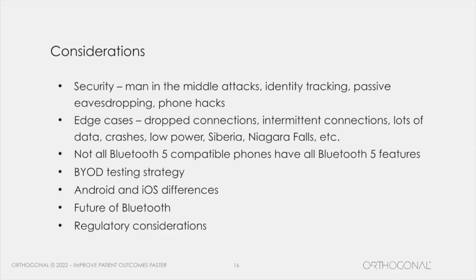Another important consideration is that just because a smartphone says, I'm compatible with Bluetooth X, does that mean that it has all of the features? Eventually, they will get most of the features, but especially for Bluetooth 5, for example, early on, not all of those phones had all of the Bluetooth 5 features. So you want to be very careful what features you are leveraging and using as part of that.